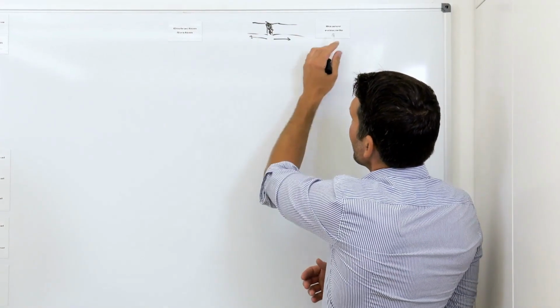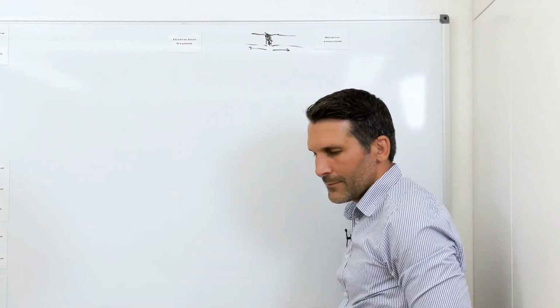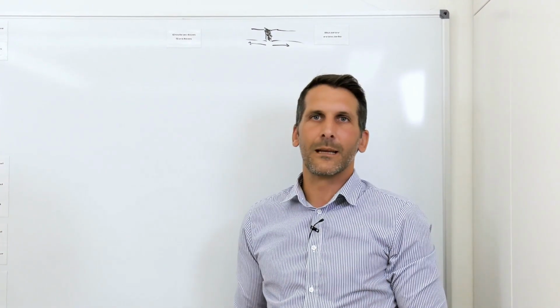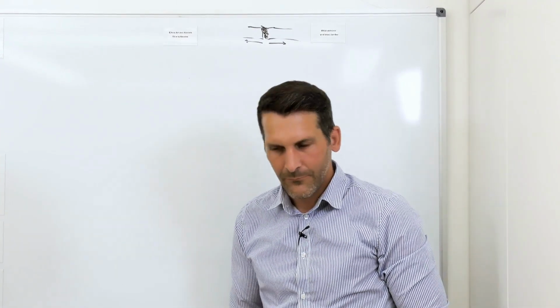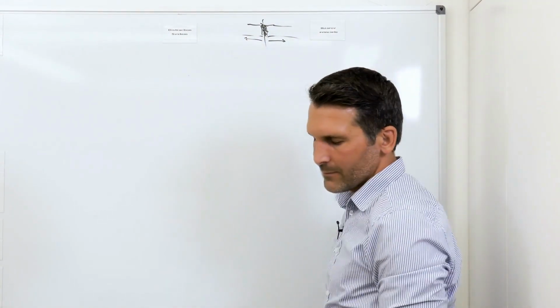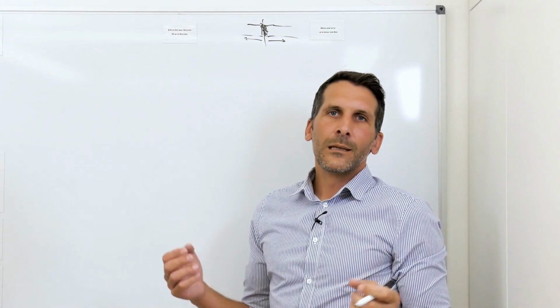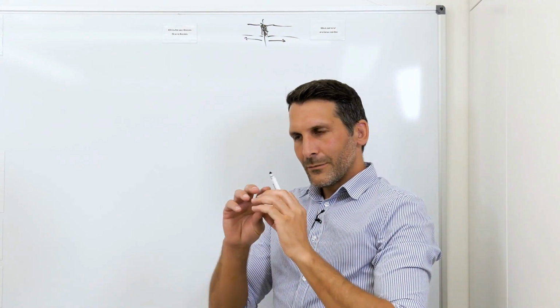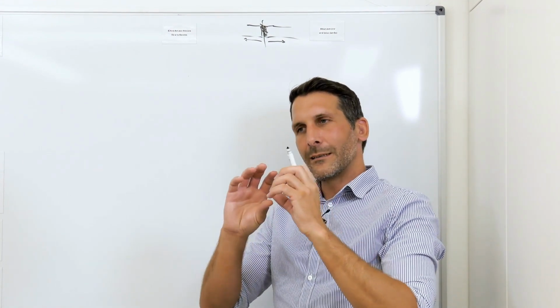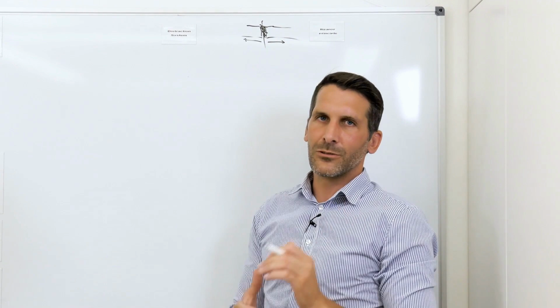So, now we have this Ilizarov principle, and apply it to our legs. That means we want to lengthen the legs. Accordingly, we inevitably have to cut through the bone. It doesn't work quite differently. And we need to pull these two fracture ends, that is, these two bone ends, apart at a defined speed.